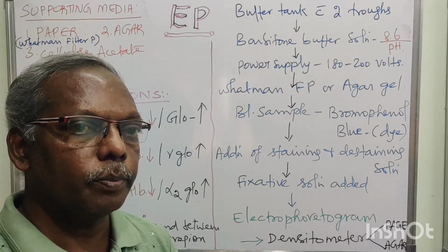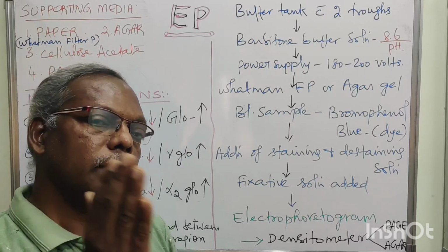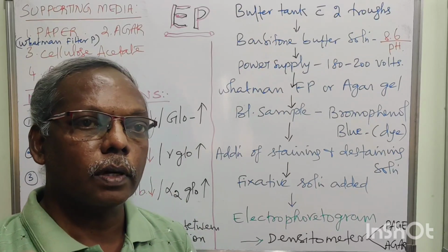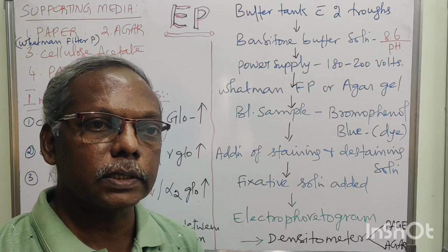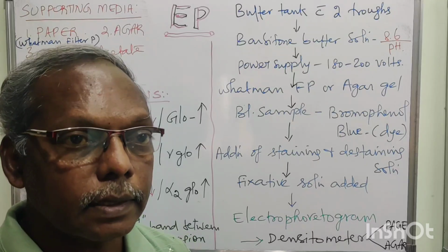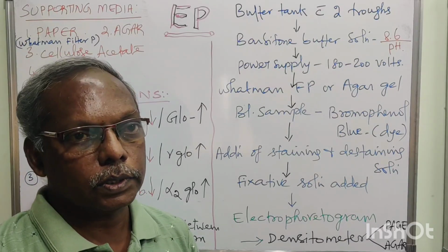First you have to see the albumin picture. Width and band of albumin shows whether the albumin synthesis is less or normal. If it is normal, go and look for alpha 1 and alpha 2. Alpha 2 is the commonly occurring situation, nephrotic syndrome. The band will be raised or increased. Like that you have to interpret all the 4 conditions for electrophoresis. Okay.